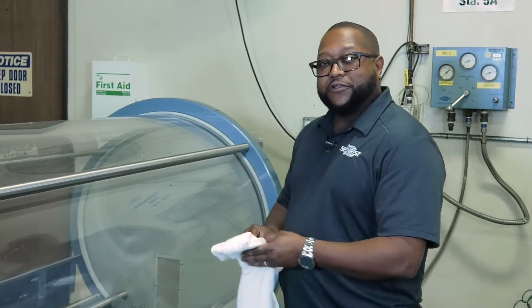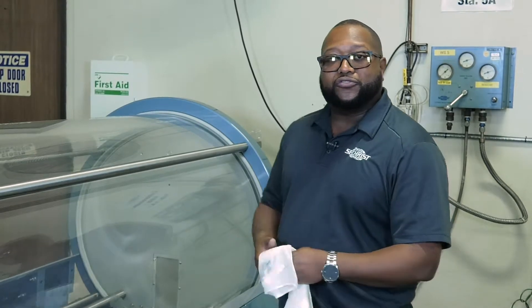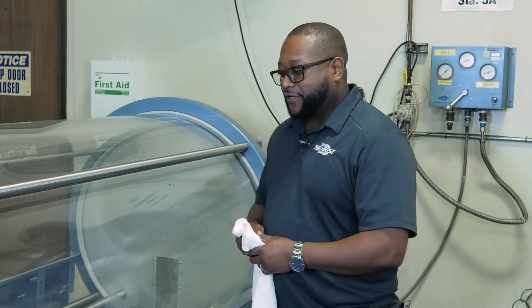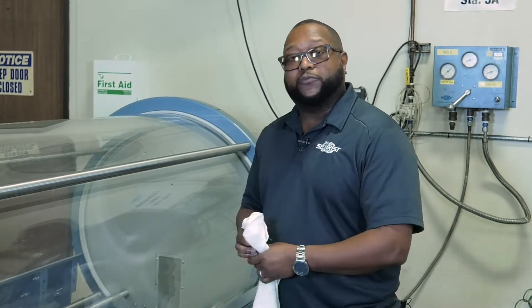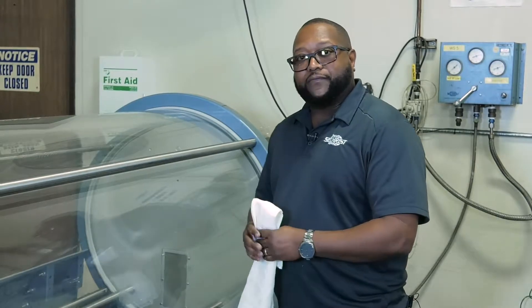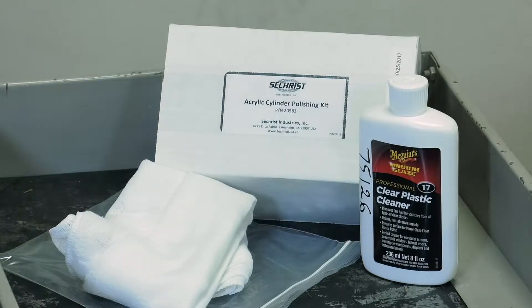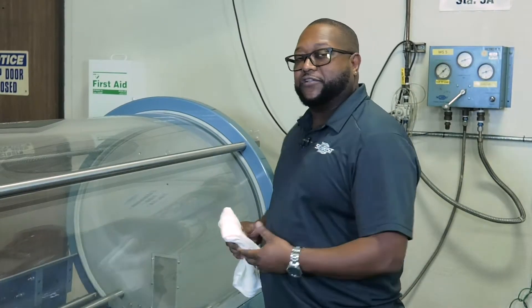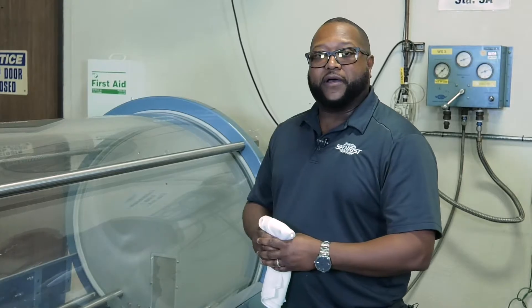Again, with this polishing kit, this is going to be used to remove light scuffs and potentially small scratches. There would be another video to remove scratches if needed. We do recommend this maybe once a week. The cylinder polishing kit we have here is a 30-day kit, and that will allow you at least one weekly polishing of the entire cylinder for about a month.